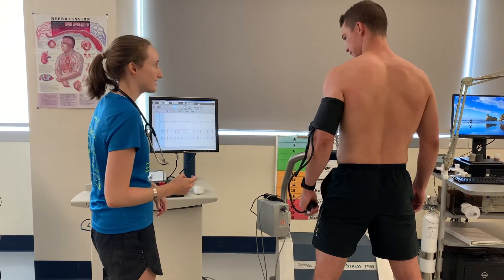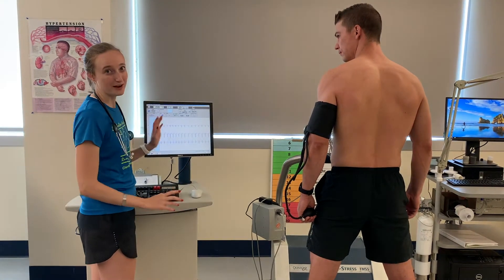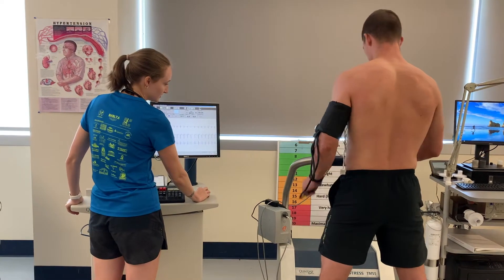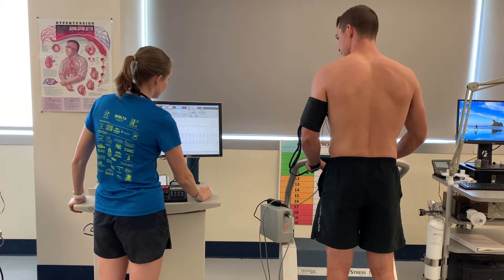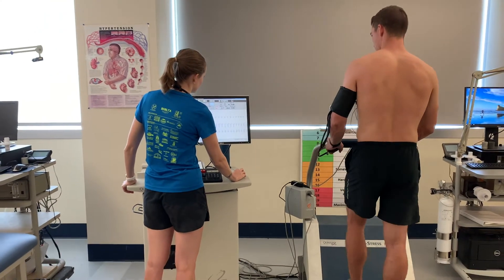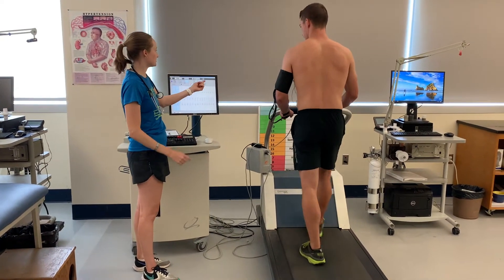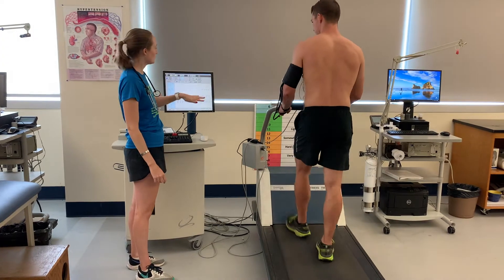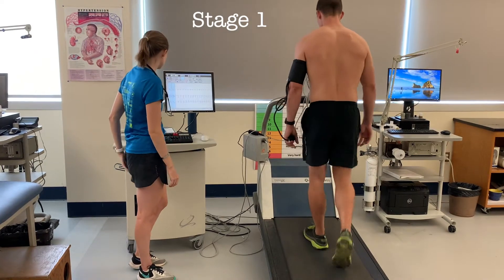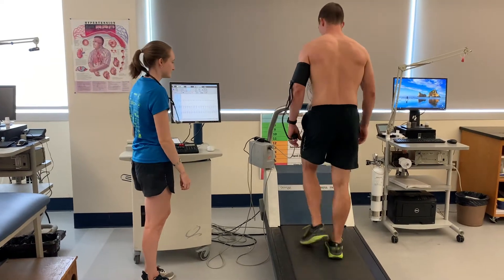Are you ready to get going? Let's do it. The nice thing about this treadmill is it will run the Bruce protocol by itself, so you can go ahead and step on the belt and I will start the belt. I'll start you at stage one, and it will automatically time the whole stage as well as his total exercise time, which is important to know. We will be here for three minutes at stage one.